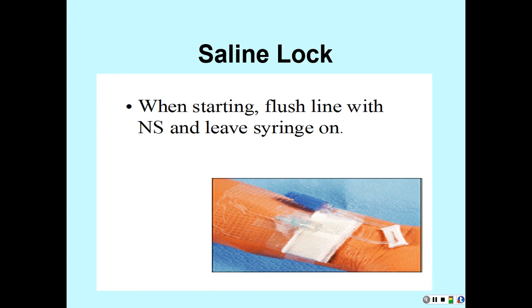They don't last quite as long because we have to make sure that they stay patent. Okay, so remember we said you're starting your IV, and then we usually connect an extension tubing or an extension set onto your saline lock or onto your IV catheter. What color is that right there? What size is that? That's a 22. It's blue.